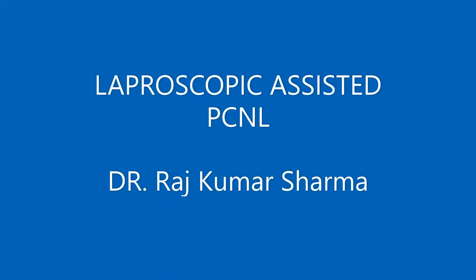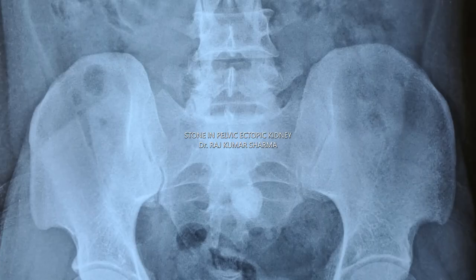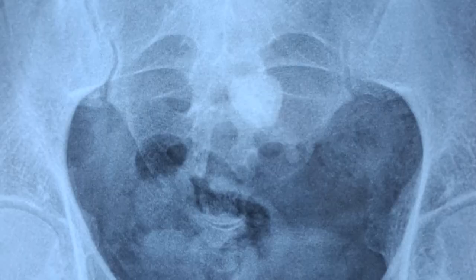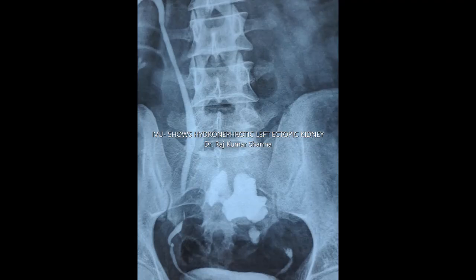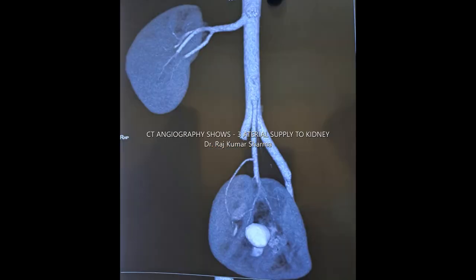This is a case of laparoscopic assisted PCNL where the stone is located in an ectopic left pelvic kidney. This is the IVP. This is CT angiography where three arterial supplies were found to this kidney.